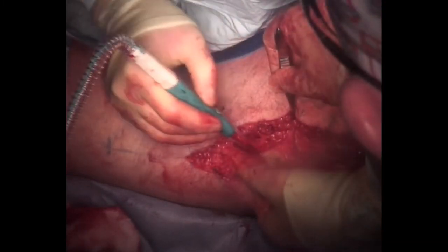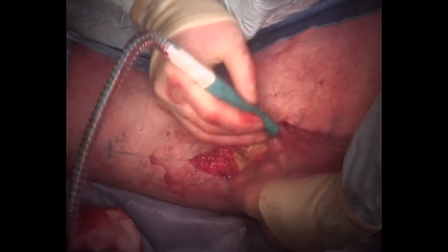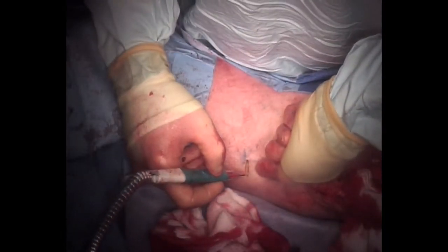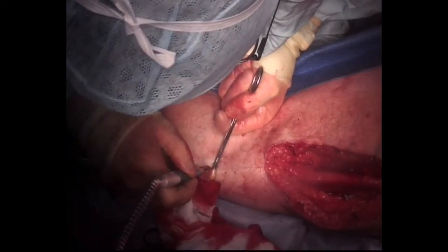Care is taken to avoid the long saphenous vein and medial cutaneous nerve of the thigh. The distal tendon is followed subcutaneously to its insertion inferior to the medial condyle of the tibia. The overlying skin and subcutaneous tissue are incised and the tendon is isolated. Confirmation that the correct tendon has been identified can be ascertained by pulling on the muscle belly as demonstrated. The tendon is divided using diathermy.